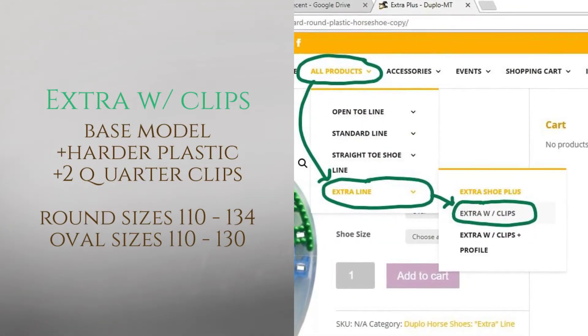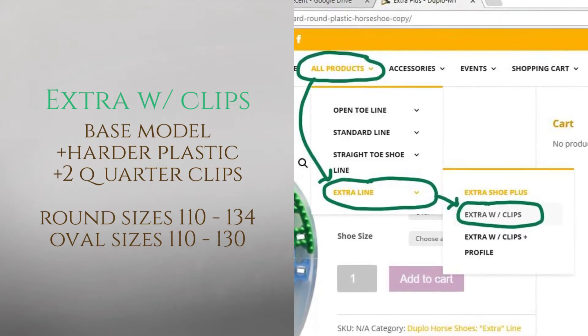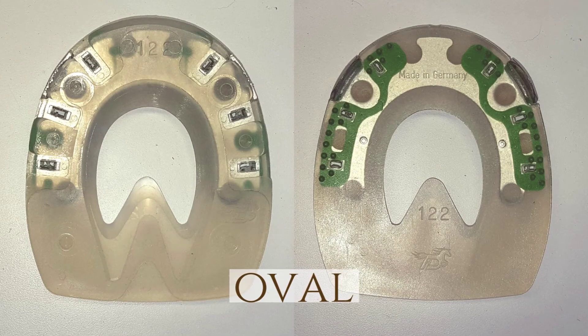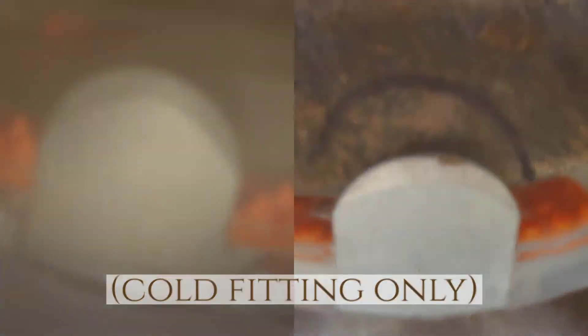Under products, scroll down to the extra line where you will find the extra with clips. We currently carry 110 to 134 in the round pattern. For the oval we carry 110 to 130. Our disclaimer is that you must only cold fit your clips.